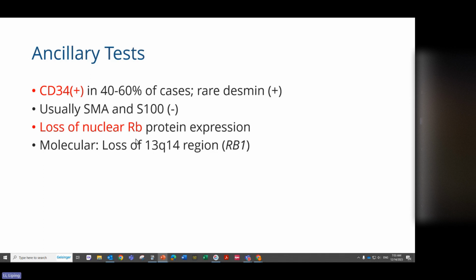Anyone have any idea what the other 3 entities are? I can tell you the location. One is from the breast. One is from soft tissue. One is from the acral site, that is the finger. Can anyone remember what entity has this immunostaining feature?